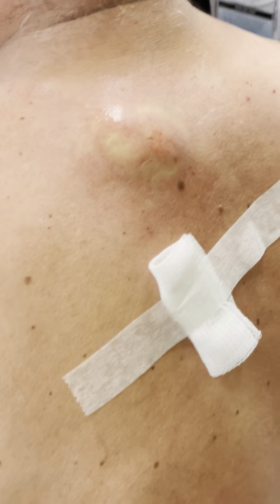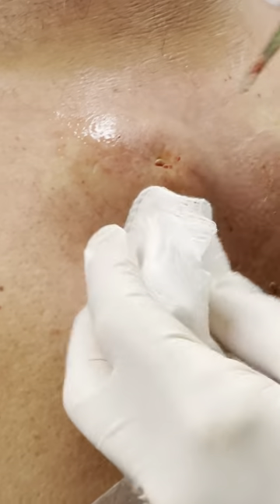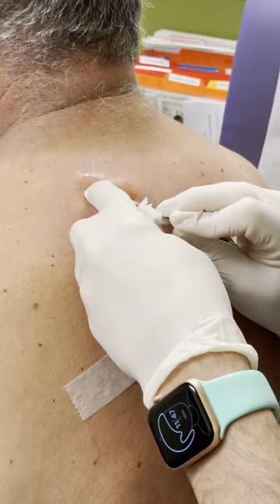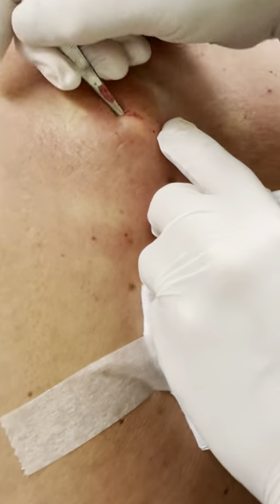It's not coming out easy, so we're going to use this. What this does is it loosens it up a little bit. It allows me to go after it, and you can go in a little bit closer if you want, just to get a nice feel of it.